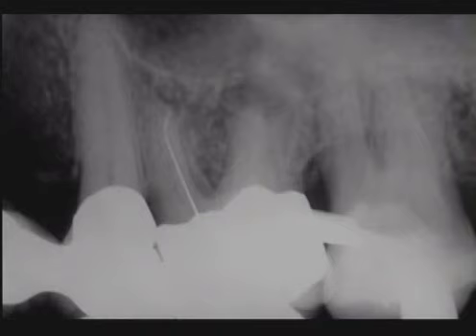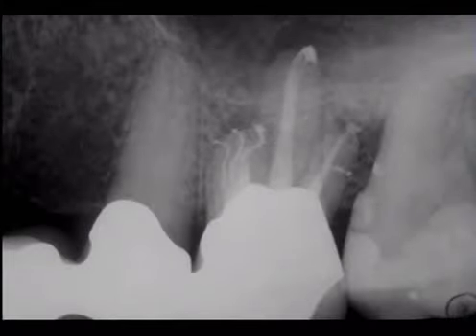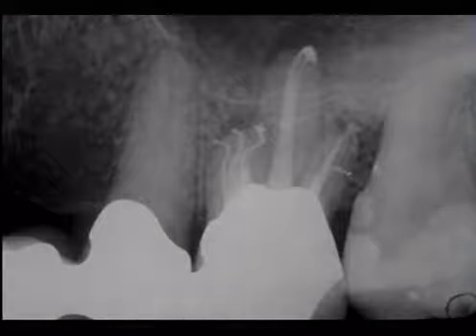In another working film taken even more distally to the previous film, notice the secret to endodontic success. A pre-flared canal allows a small-sized file to slide through multiplanar curvature and to length. Notice the furcal side concavity. It's exciting to look at a post-operative film when we've completely followed and fulfilled the mechanical objectives for cleaning and shaping canals. Notice the recurvatures, the bifidity, the lateral canal, and the multiple apical portals of exit.